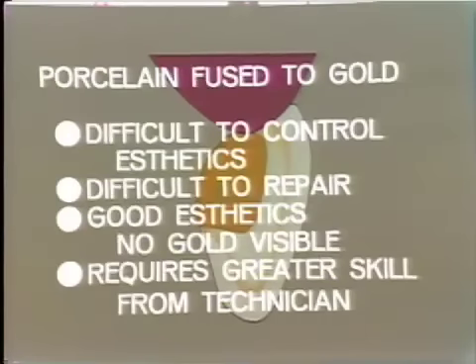They do require greater skill from the technician, both in the development of the gold core to their correct and effective shape, and also in the blending and the molding of the porcelain to the correct mold and the correct shade.